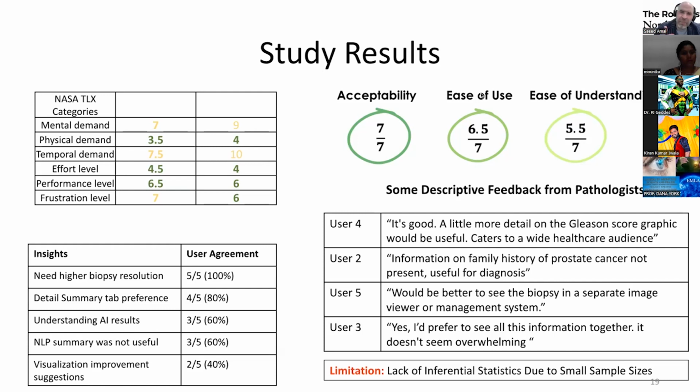So, as an example, they would like to open a special viewer for the pathology, so they can already inspect those areas. And then some would say, I want the whole information on the same screen, like the donut chart and the other information about the patient. It would be useful rather than clicking on a button. And this was part of what we wanted to evaluate.